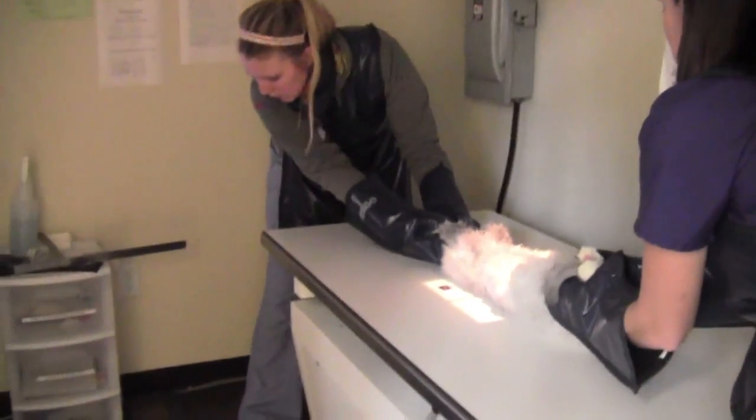Making sure that my marker is cranial to the axilla, I will then take my X-ray during inspiration.